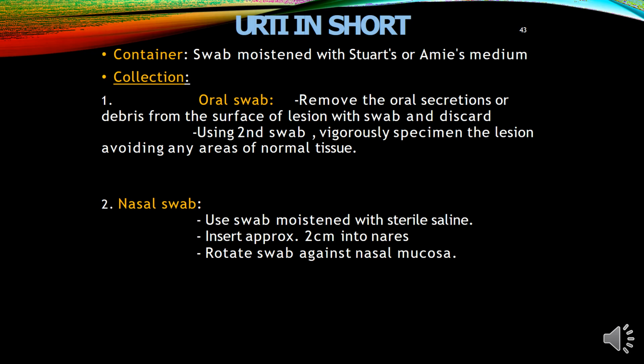Nasal swab. Use a swab moistened with sterile saline. Insert approximately 2 cm into the nares. Rotate the swab gently against the nasal mucosa.